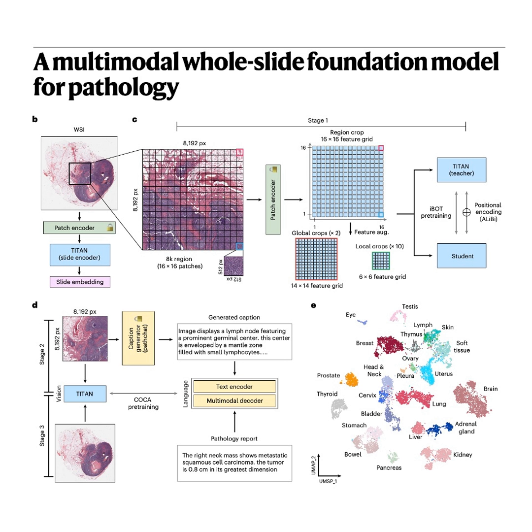And this extends to language output as well. For report generation, Titan substantially outperforms Prism by an average of 161% across measures of textual quality. The reports it generates correctly capture the tissue site, the diagnosis, the tumor grade, all the relevant details. It's an immediate assistant for an overworked pathologist.